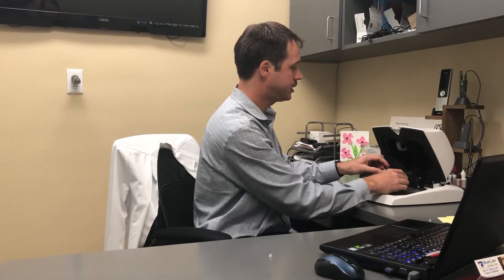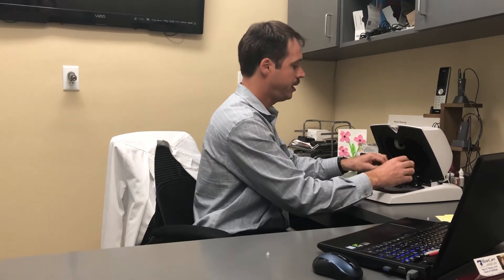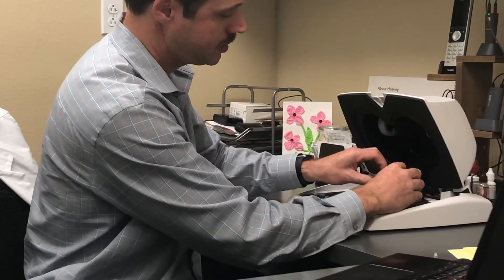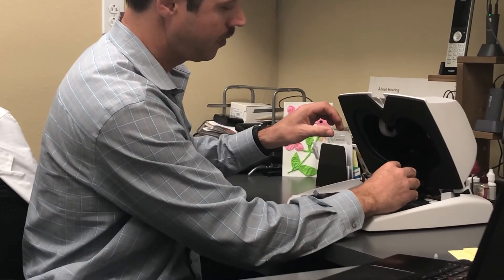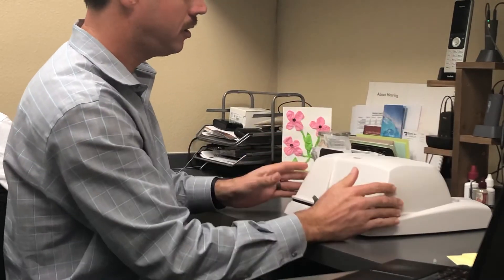What we're going to do is slide this over next to the front microphone, just like this. Make sure they're pretty close. Close the box. The wonderful thing is now I can work everything from the computer on the other side to make sure that all apparatuses within the hearing aid are going to work appropriately to manufacturer specifications.